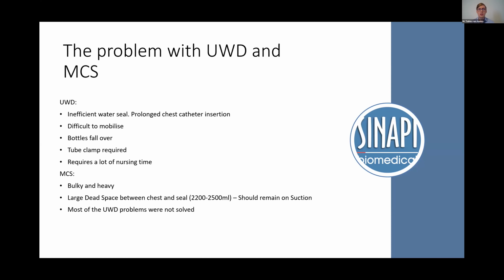On the right-hand side, when there's no air drainage coming through, it remains depressed. So this is a very good sign. Firstly, it gives you a little bit of manual pressure. So it is draining, but there's no air being drained.